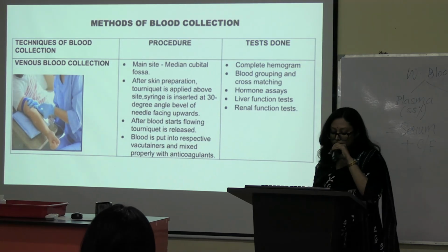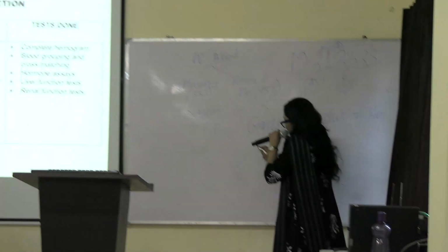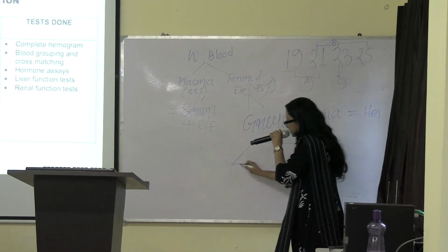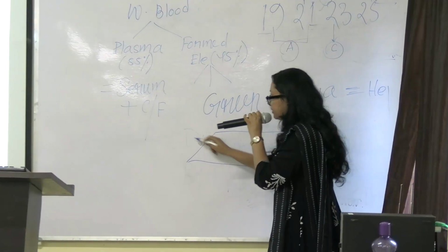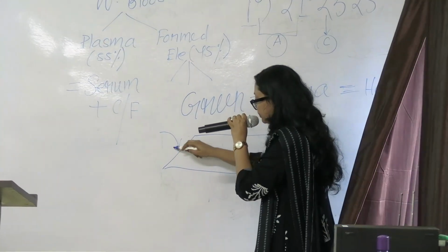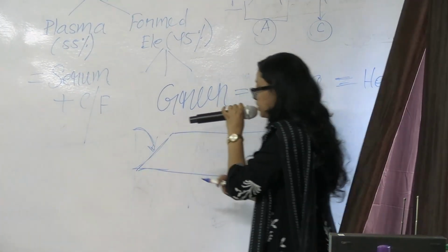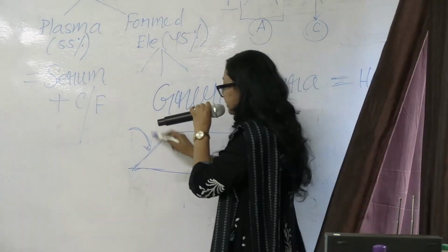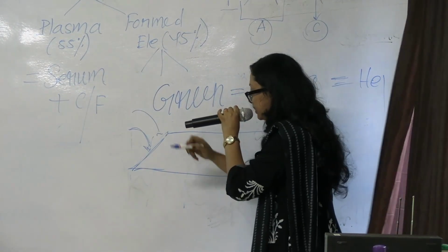Remember, the syringe which contains the needle. So it is like that. This is the beveled end. The beveled end is always kept up. So this will stay up, okay?